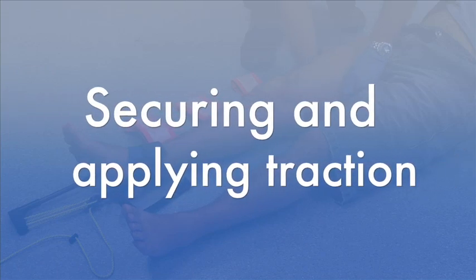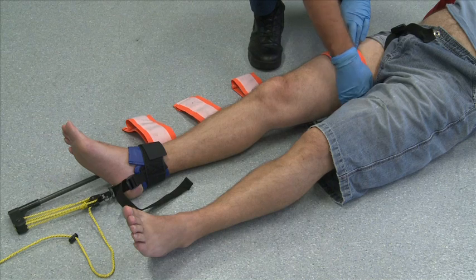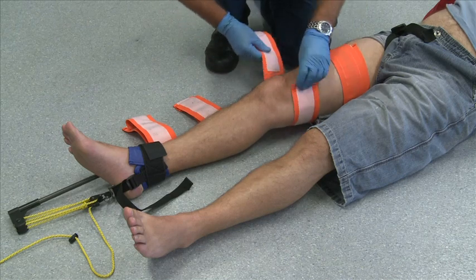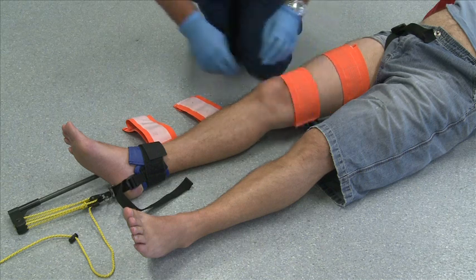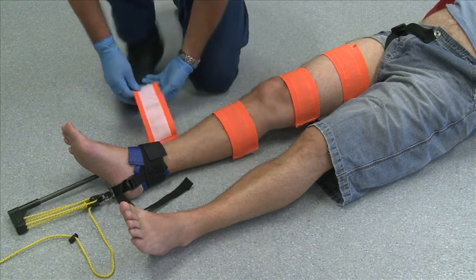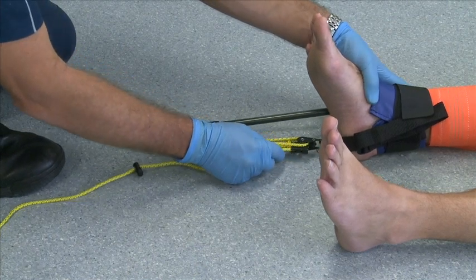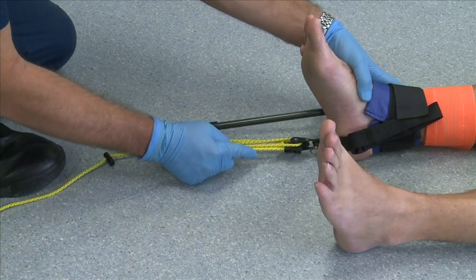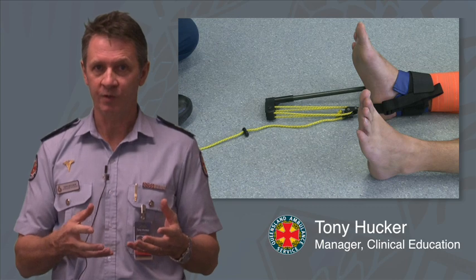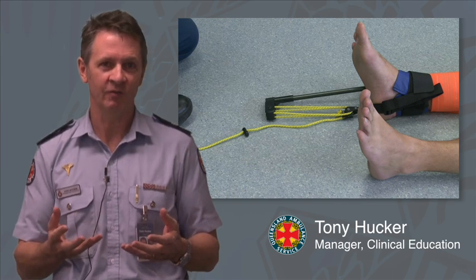Step 9 — Securing and applying traction: the first strap is placed around the upper inner thigh, ideally above the fracture. The second strap is wrapped above the knee, ideally below the fracture. The third strap is placed below the knee, and the fourth strap is placed directly above the ankle hitch. Apply traction as required by readjusting the tension until the patient's comfort is achieved. Applying traction with the CT6 is a little different to the Donway — with the Donway there is a gauge that gives a reference point when enough traction is applied.